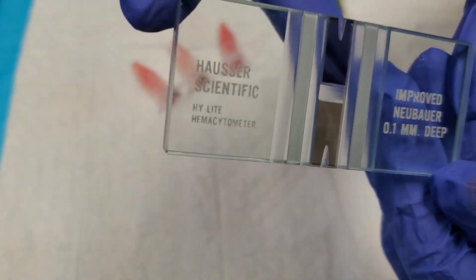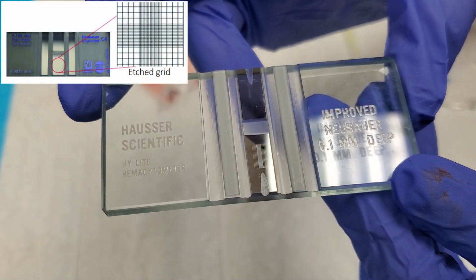Now what I'm going to do is I'm going to load this up on a special slide called a hemocytometer. The hemocytometer is going to take 10 microliters of this diluted blood and spread it out over an entire plane on the slide. Now the slide is such that there's actually etched lines in there, and it makes a grid of sorts. Now there's still too many cells to count all of the cells that will be on the slide, but what we can do is take a random sample using the grid technique. So next I'm going to show you how to load up a hemocytometer.